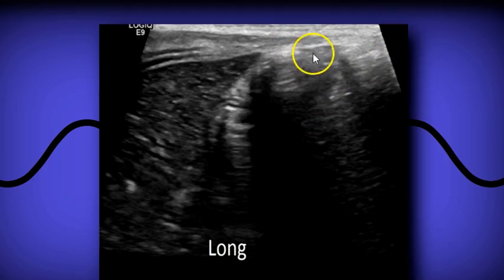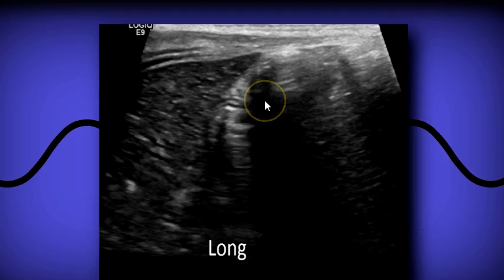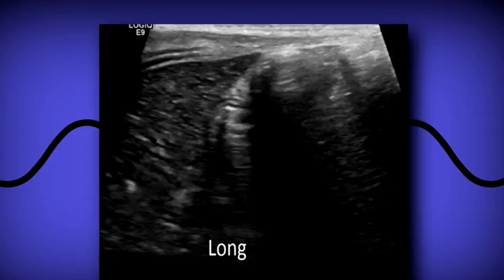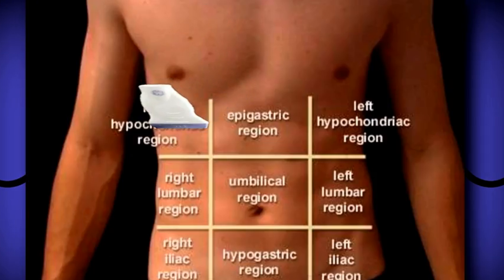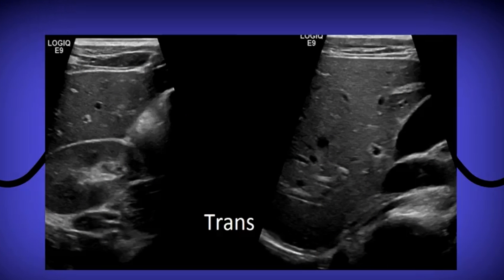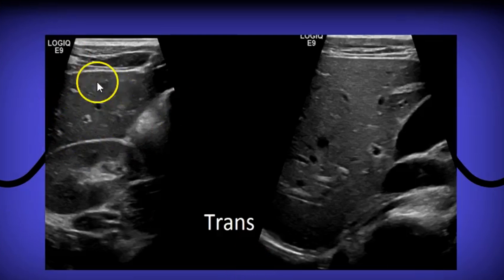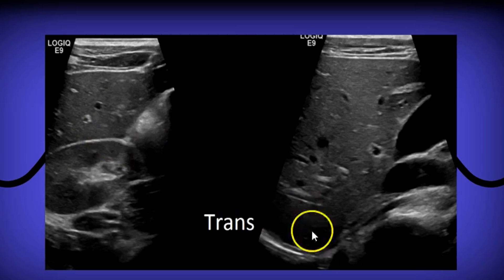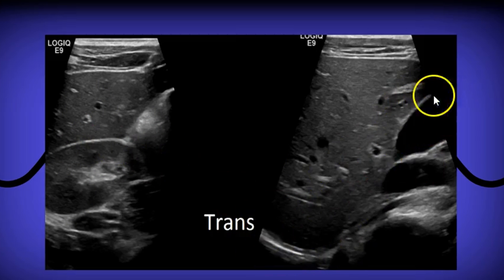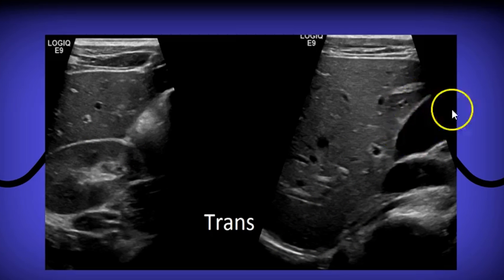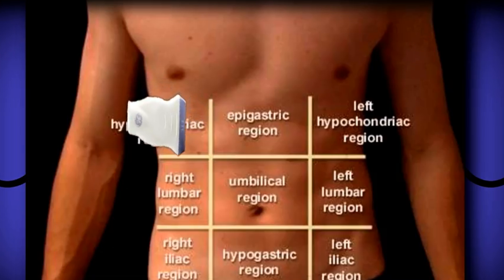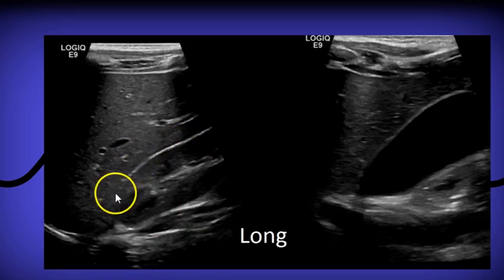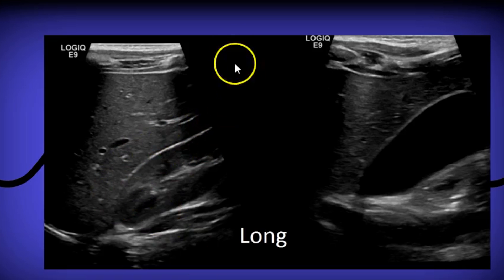You're not going to find an intussusception here — a very severe intussusception can go all the way through to the transverse colon, but that's not common. Moving on to the right upper quadrant transverse, you have your liver and right kidney. This is a good view to rule out free fluid in Morrison's pouch, and you also have the diaphragm and your gallbladder to rule out stones.